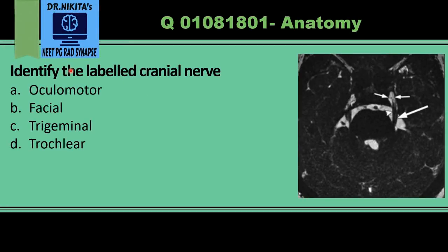Identify the labeled cranial nerve. This is a T2-weighted MRI where the CSF is white — a highly T2-weighted MRI used for cranial nerves. When a patient has symptoms related to cranial nerves like trigeminal neuralgia, sensorineural hearing loss, etc., we use a CISS or DRIVE sequence, which is a heavily T2-weighted 3D sequence for the cranial nerves.